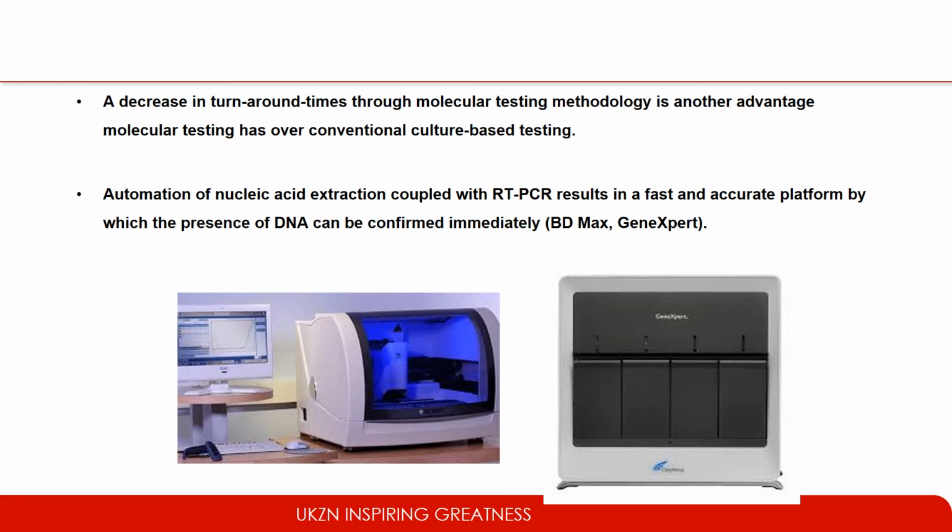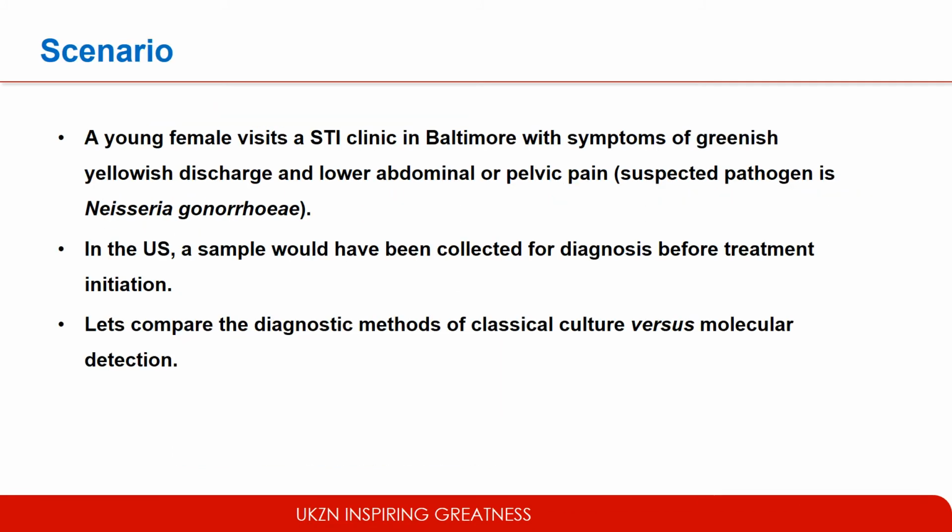They have FDA approval. So let's look at a scenario. We did say that molecular-based assays are more superior to conventional culture-based assays. So let's look at how this is possible. A young female visits the STI clinic in Baltimore, USA, with symptoms of greenish yellowish discharge and lower abdominal or pelvic pain. The suspected pathogen to the clinician is Neisseria gonorrhea.